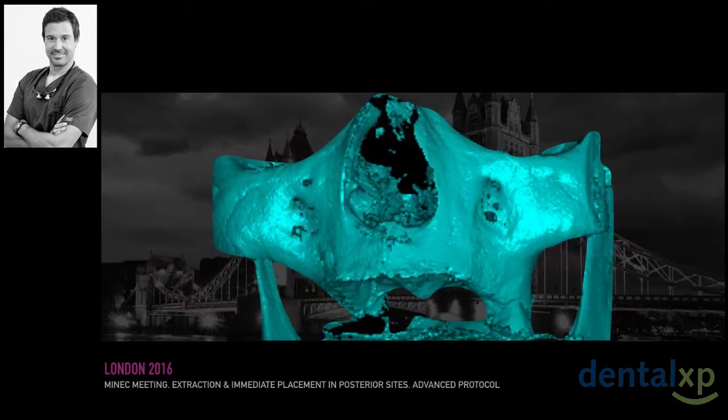Looking at this 3D interpretation out of a CBCT, we can observe the preservation of the bone even under non-healthy periodontal conditions of that tooth, compared to the severely atrophic edentulous areas.